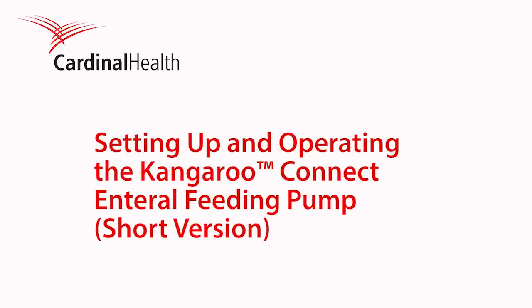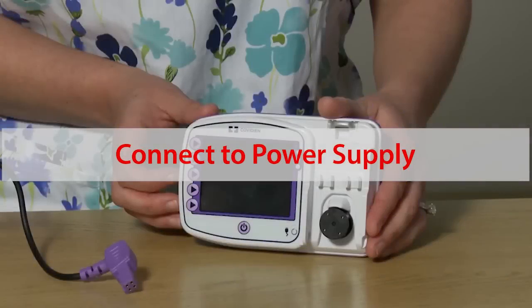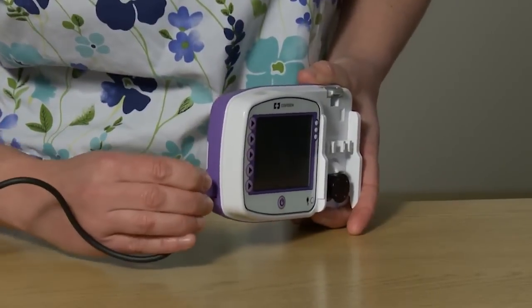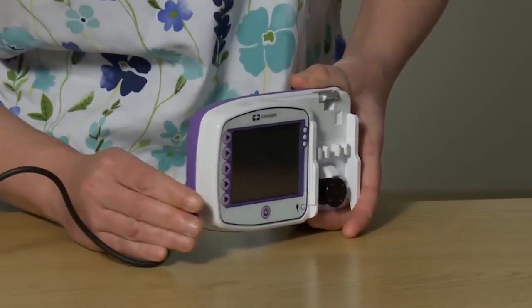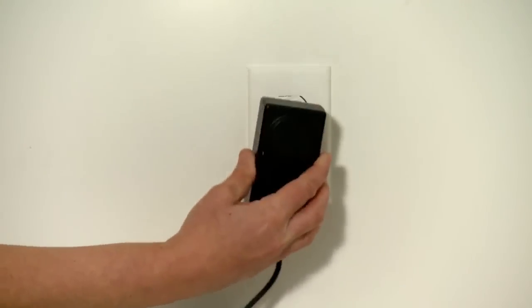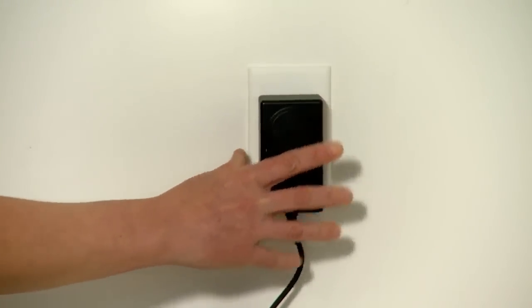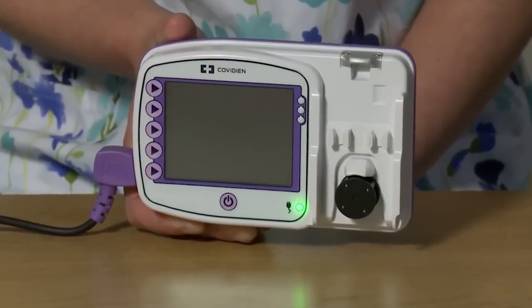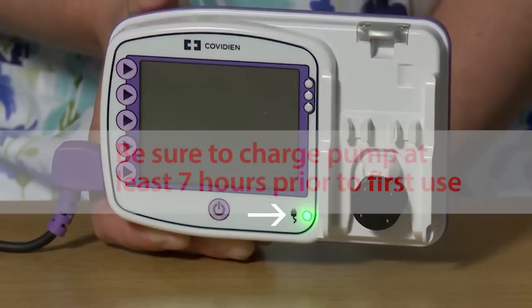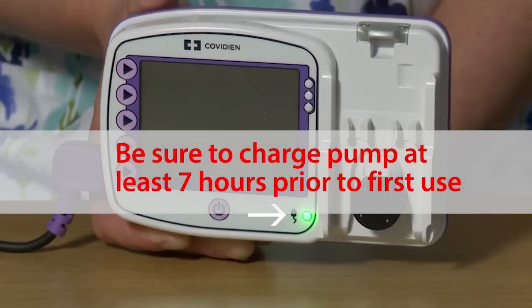Before you begin using the pump, you will need to be sure that it is fully charged or connected to a power supply. Plug the power adapter into the power adapter port located on the left side of the pump. Plug the other, two-prong end of the power adapter into a nearby AC outlet. Check to see that the AC indicator light is on to confirm that the pump is receiving power from the wall outlet. Be sure to charge the pump for a minimum of seven hours before initial use.